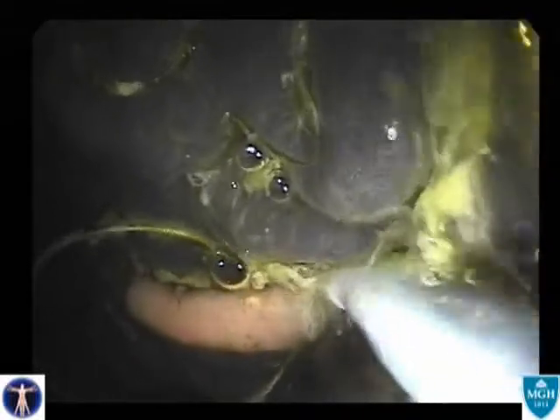This second example demonstrates even more intense lipofuscin accumulation in the colon. Here the cecal epithelium is so pigment congested that it is difficult for the endoscope processor to generate adequate illumination. This polypoid structure stands out due to the absence of pigment. Because it is suspected of being a polyp, it is removed by the cold snare technique and sent for pathologic examination.